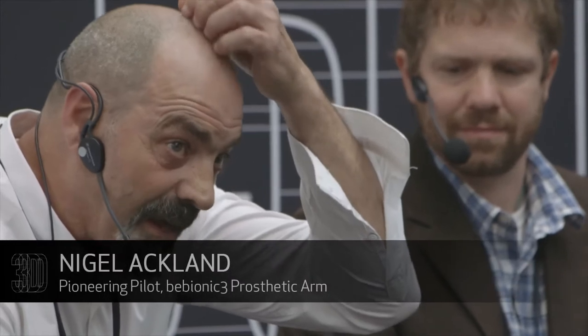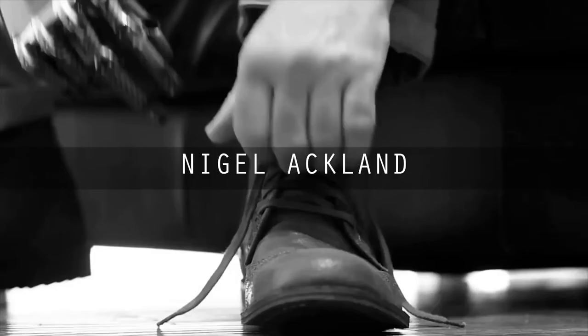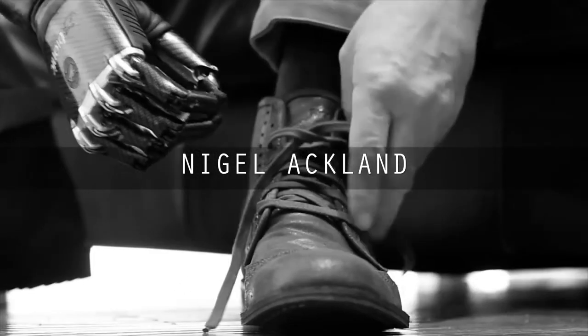My journey started by accident in 2006, and in 2007 I became an amputee. I went on a standard treatment plan, so I've had quite a few of the prosthetics. I started with a passive limb, moved on to a body-powered system, which is a hook powered by a piece of string. Then I moved on to an electric, like lobster claw, which is pretty effective and pretty functional. Then I was fortunate to get this. This came purely by chance.